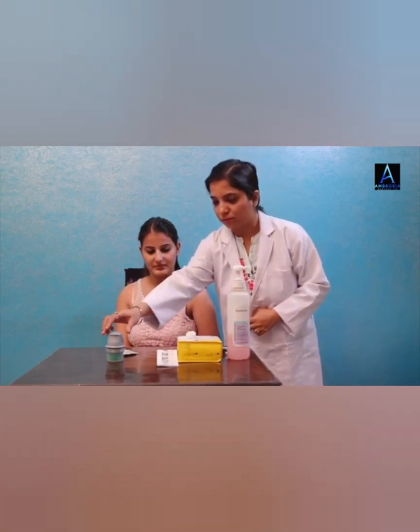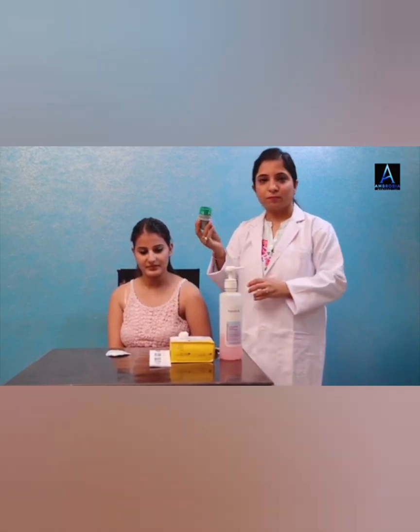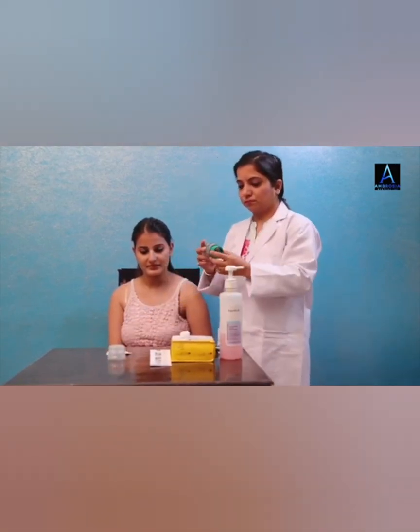Now we are going to unscrew the cap from the sensor applicator and set the cap aside. Line up the dark mark on the sensor applicator with the dark mark on the sensor pack. Press it firmly down on the sensor applicator until it comes to a stop. Lift the sensor applicator out of the sensor pack. The sensor applicator is prepared and ready to apply the sensor.